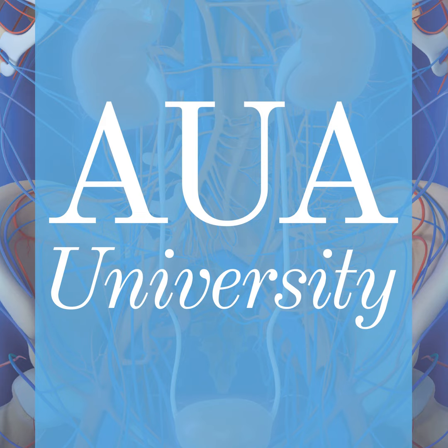Yeah, perfect. So everybody did listen to my previous elucidations to the slides. The biopsy is the best way to do. And this is what we did, and the biopsy demonstrated sarcoidosis. So again, highlighting the fact, whenever you have a PSMA avid lesion in some unusual anatomic areas, please just get a biopsy prior to the treatment.